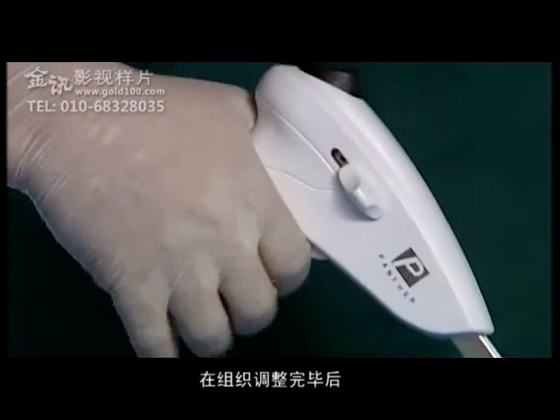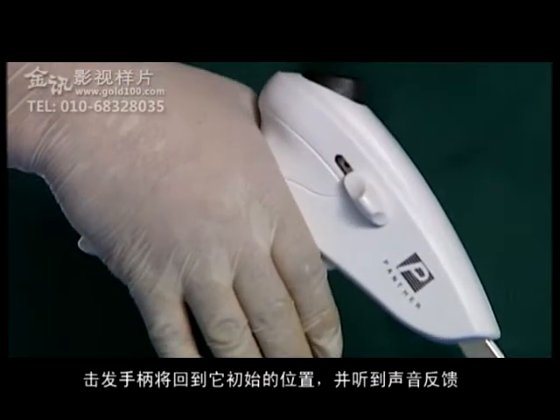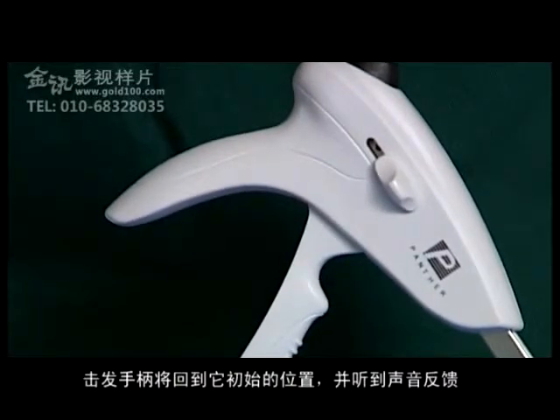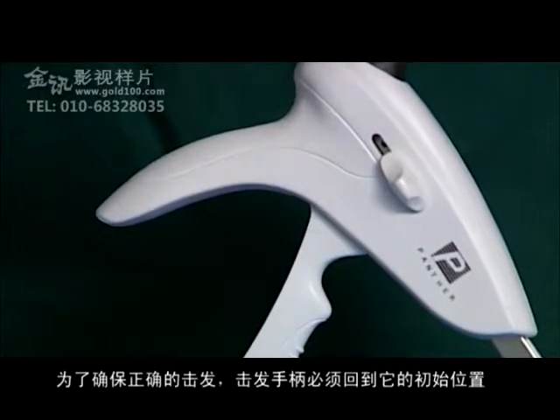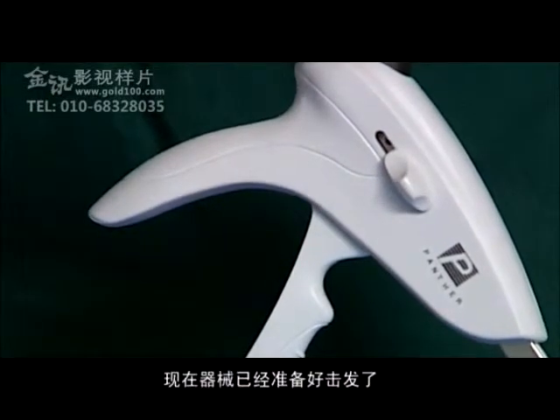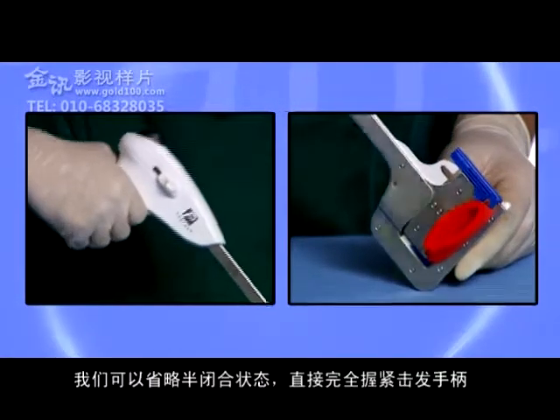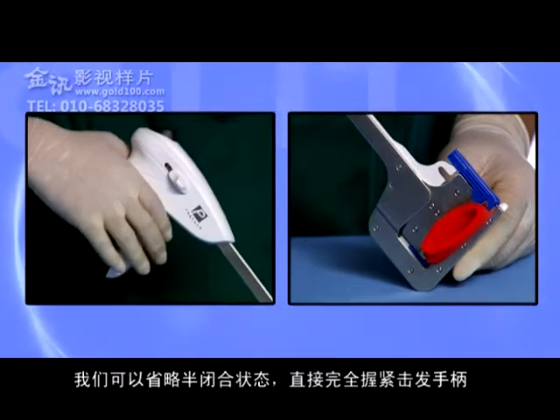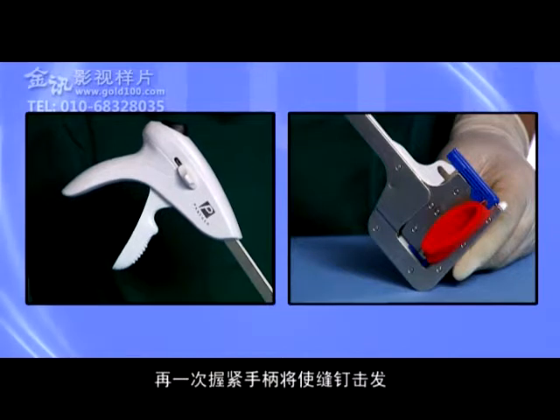After the tissue is properly positioned, complete the squeeze and release the handle, which will return to its original extended position with an audible click. To ensure proper firing, the handle must return to this original position. The instrument is now ready to fire. Note: it is possible to bypass the pre-clamp phase with a rapid full squeeze, and then a return of the handle to its original position. The next squeeze of the handle will fire the staples.